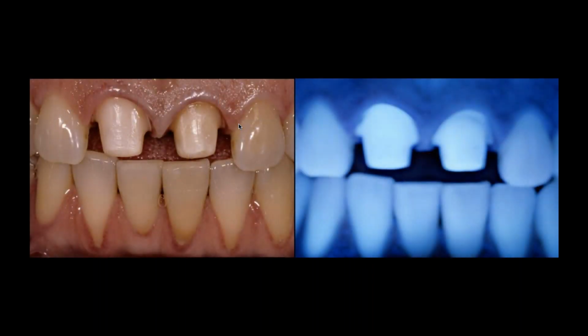I'm not always right, by the way. I wish I could say every case was perfect. Not the case. Many times I look at something that I'm done with, and I'm thinking, wrong material, wrong choice, wrong powders, wrong firing parameters. It could be a million things, but in the end, it's all based off optics of nature. Is that what we're trying to accomplish?